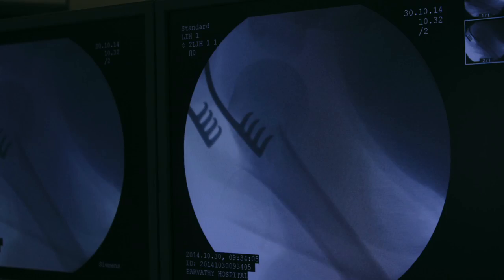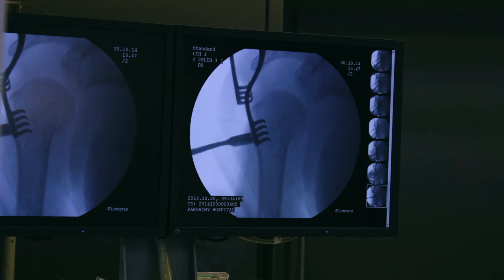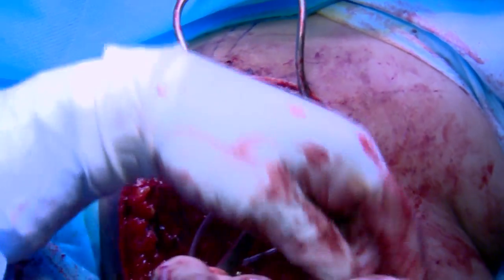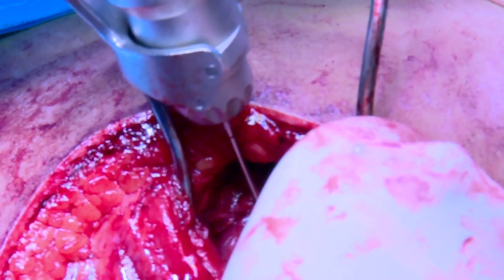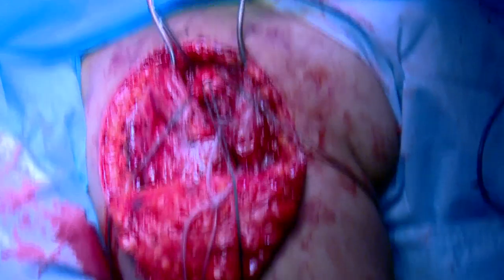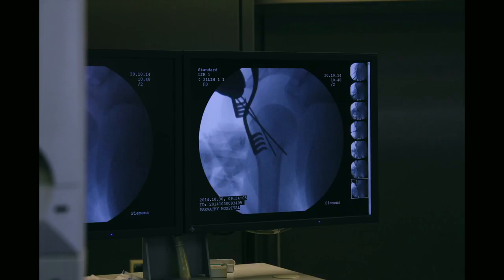This 2-part surgical neck fracture with varus displacement is reduced by pulling on the traction sutures to bring the humeral head out of varus. The humeral shaft is simultaneously pushed medially under the humeral head. Once satisfactory reduction is confirmed, K-wires are inserted from the top of the greater tuberosity into the medial calcar to provisionally hold the reduction. Placement of K-wires should be such that they do not interfere with definitive fixation.